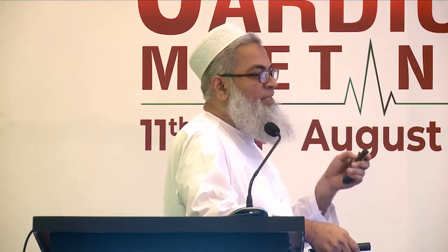So it's very important, and angiographically, sometimes your heart may not give you a clear orientation. Angiography will not give you a clear orientation. The most important thing is your hand position. Whatever you are looking at, if your pointer is pointing at 7 o'clock, you will go out.